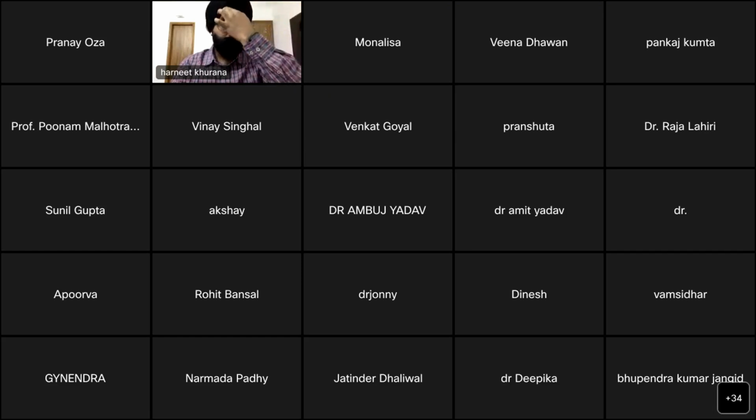Gradually we put them in proper position at 45 degrees, 60 degrees, 90 degrees, and we see whether they tolerate, whether there's no issue with the flow and no hematoma or bleeding from around the cannula site. Then we make them sit at the bedside, keep their legs hanging, and sit them, and then we take them to a wheelchair. Once they are on the wheelchair and there are no issues, then after 1 or 2 days we make them stand and start them walking.